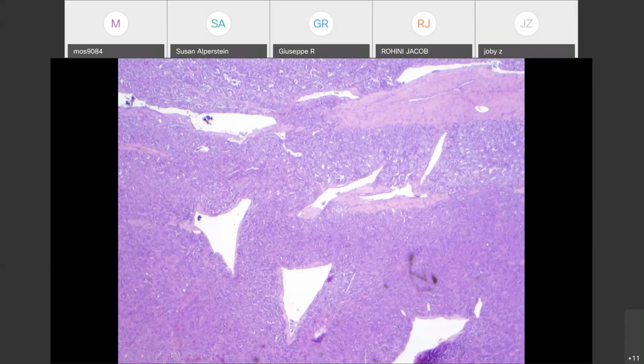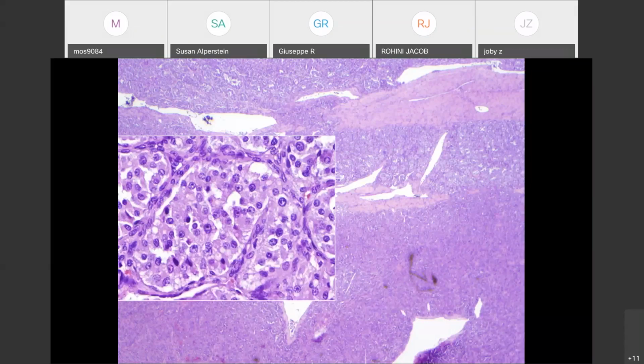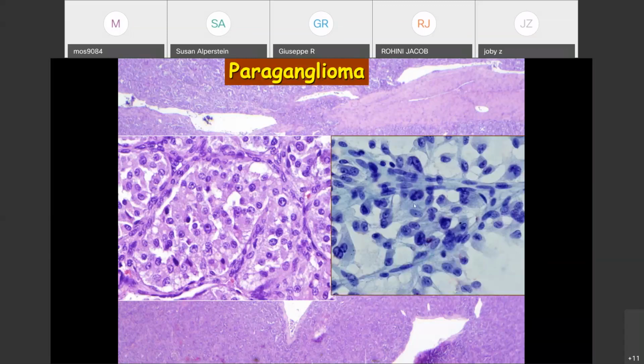Here's a record of the tumor. So you look exactly like cytology. Because the beauty of cytology smears, once you smear, you can see the cell to cell connection, cell junction. With tissue sections, you just cut it. You never have a chance to see the cell to cell junction. Cytology.